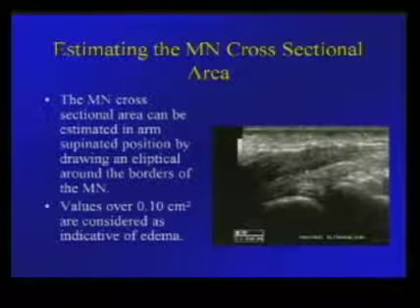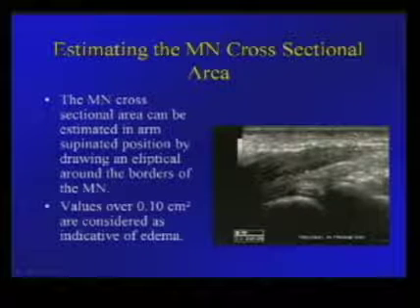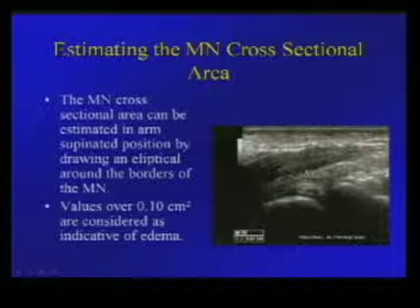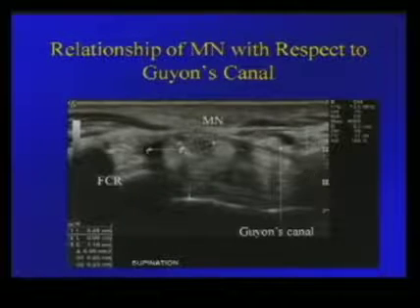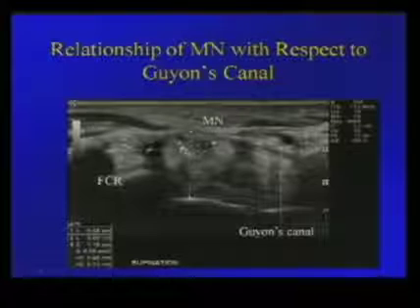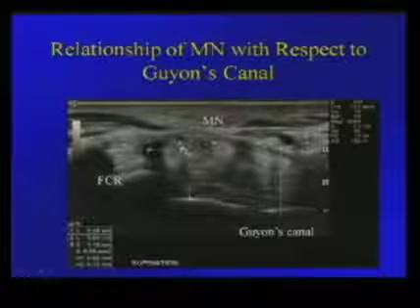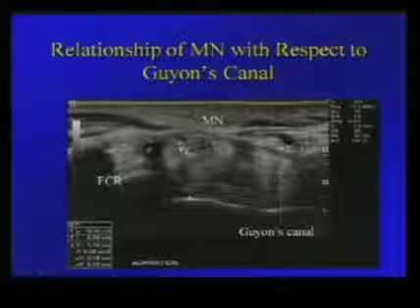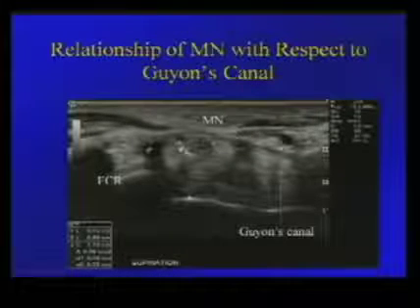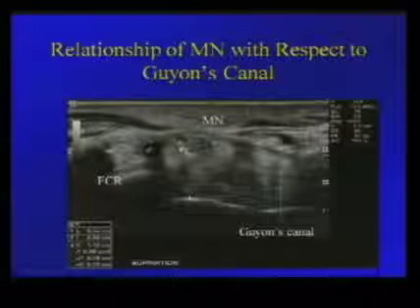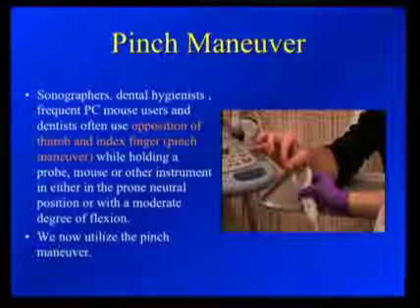Transverse images are also followed by longitudinal images showing the area of maximum swelling. Shown here is the anatomy of the median nerve in the carpal tunnel, the flexor retinaculum, relative to Guyon's canal and the location of the ulnar nerve. Note the position of the median nerve relative to the capitate and the flexor carpi radialis.